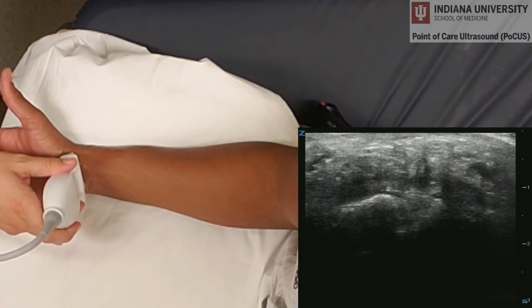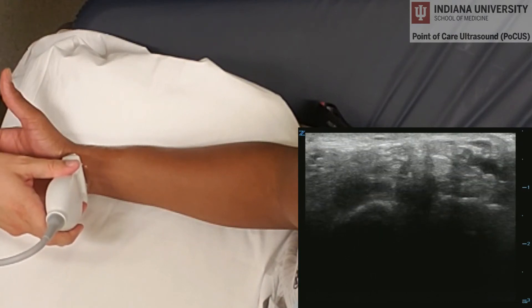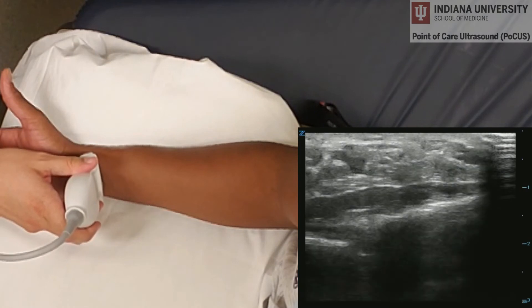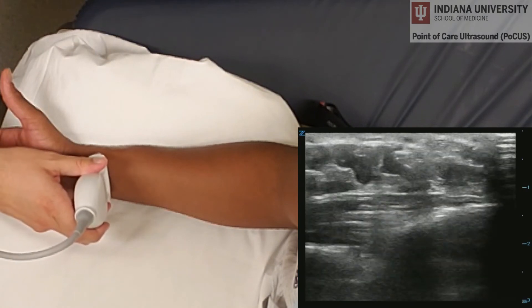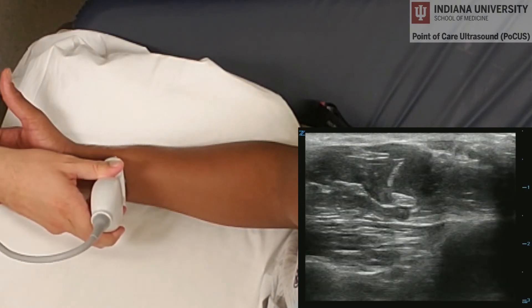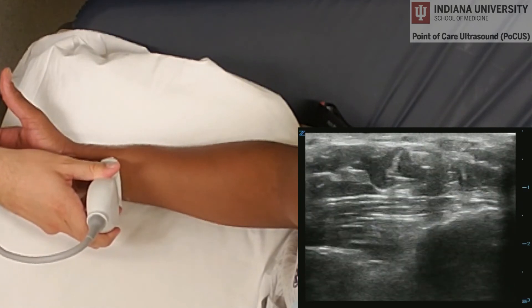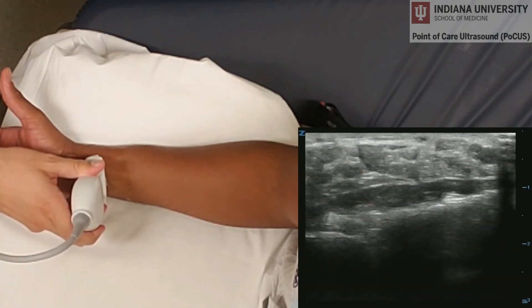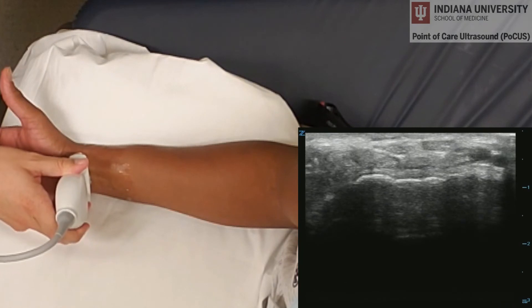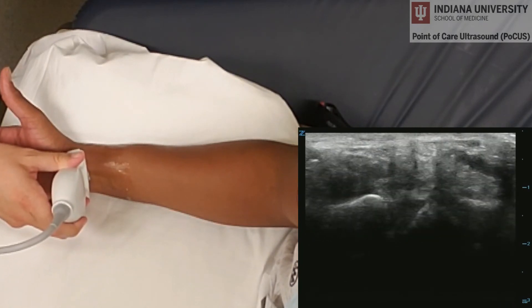Then we can move the probe more proximally and watch as the median nerve dives down deep into the muscle. As we come back more distally in the carpal tunnel, the median nerve comes back to the superficial side of the carpal tunnel.